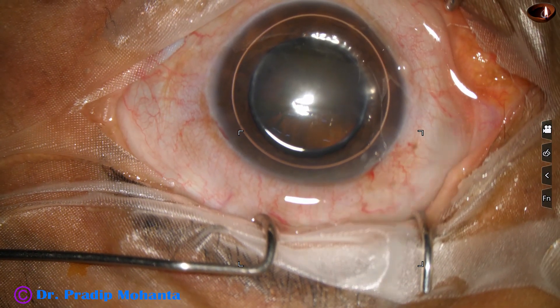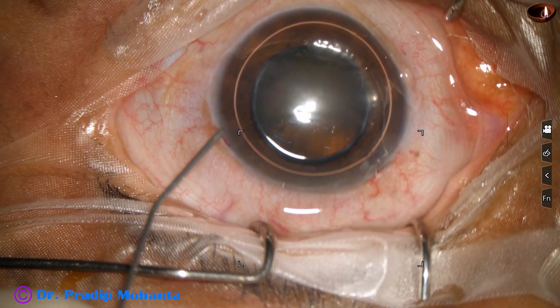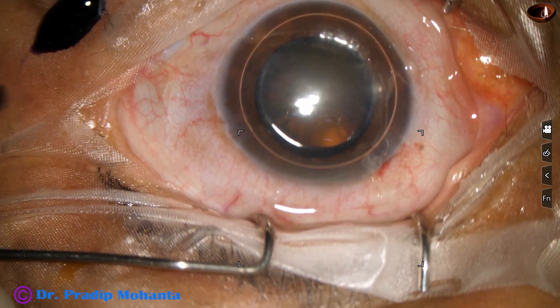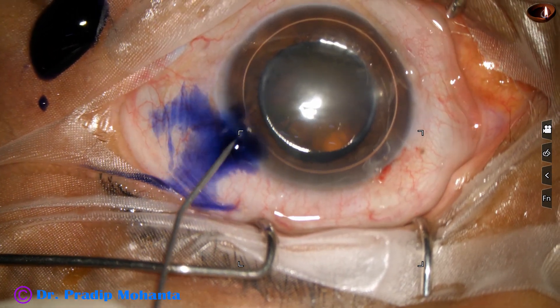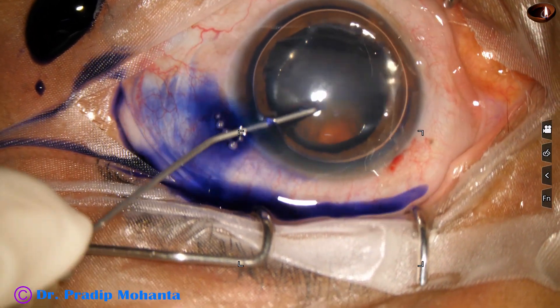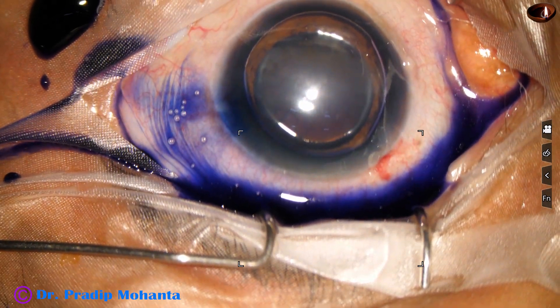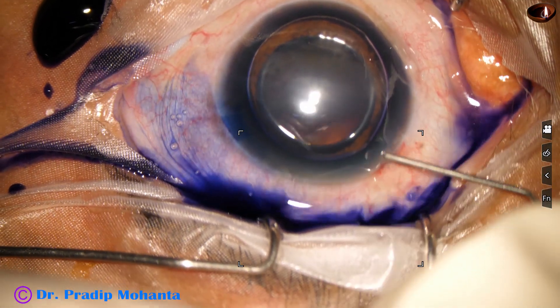An air bubble is injected, and beneath this air bubble, trypan blue dye is applied over the anterior capsule. The dye should touch all parts of the anterior capsule for uniform staining.